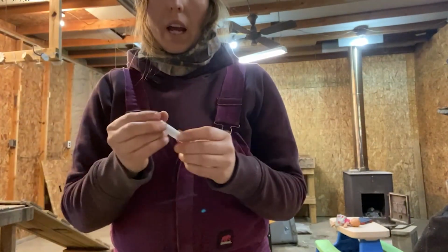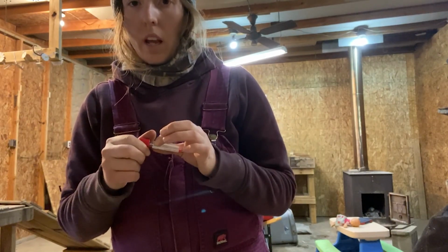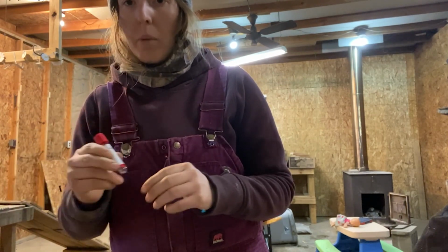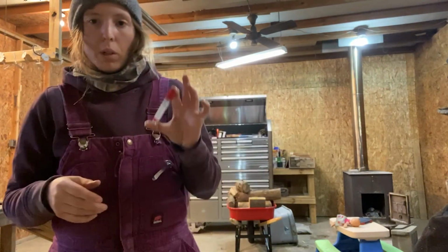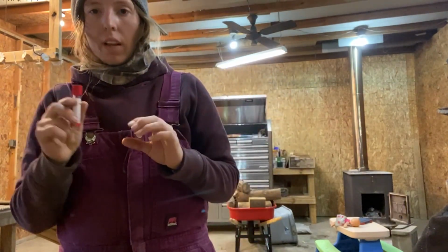So you go ahead and write, again, this is just according to UBRL, they want the ID for the animal, which I use their names, and then the tube number, and all of that correlates to the lab requisition forms. I went ahead and did that in the house, printed off that sheet, filled it out, labeled all my things, and then I came out here and we got started.